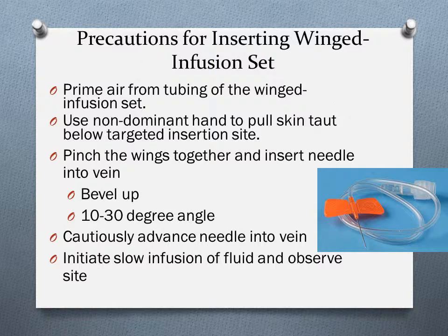Again, make sure that you pull the skin taut. And once you get into the vein, you will initiate the infusion, observing for a free flow of the fluid and for signs of infiltration.